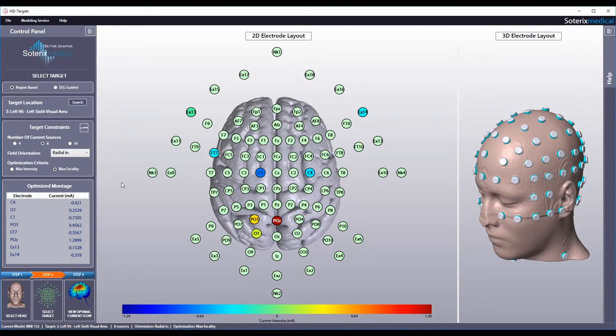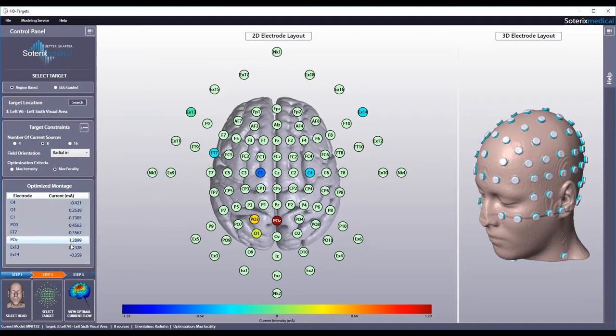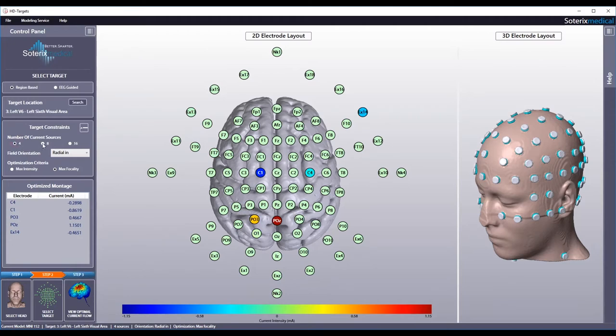For example, electrode at location C4 will need to deliver negative 0.42 mA, while the electrode at location POZ will need to deliver positive 1.29 mA. If you've selected 4 electrodes, 4 electrodes are used in total.